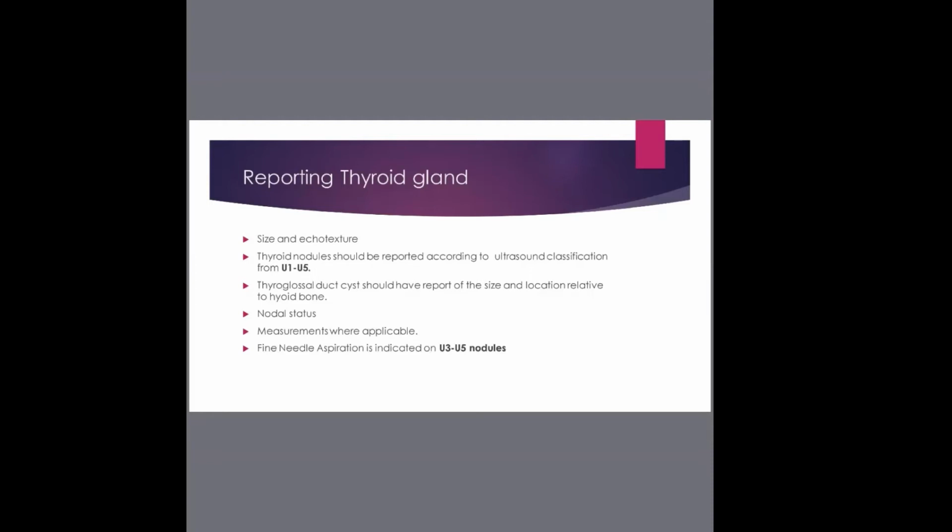It is very important that you have a conversation with your patient, and this is why you also need to be clinically versed to know how to correlate what the patient has told you, what you're seeing, to the findings. That communication is very important. Don't just depend on what a doctor queries, like neck swelling. Sometimes there's no neck swelling there. They just want to send the patient away by requesting that scan.